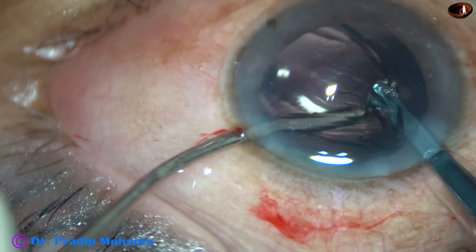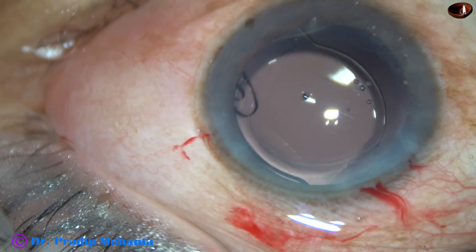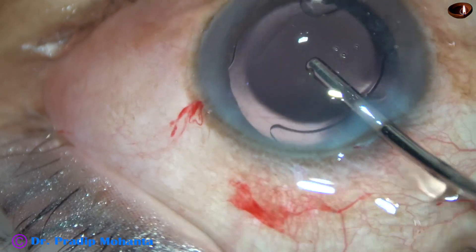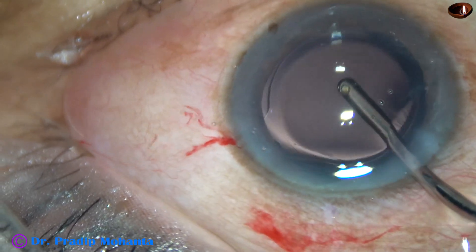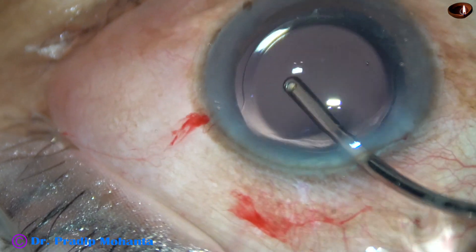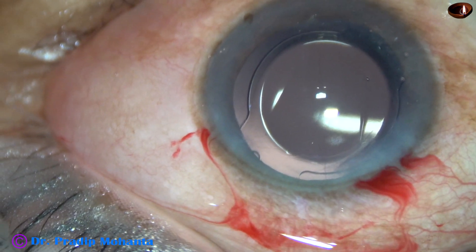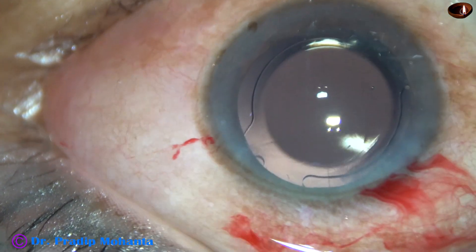And now this is hydro-implantation of a single-piece monofocal intraocular lens. One haptic is stuck to the optic, but it will get released soon. Yes, the haptic has got released from the optic. Whatever visco was there in the lumen of the cartridge has come out, and we can see that the anterior chamber is shining. The lens is shining.